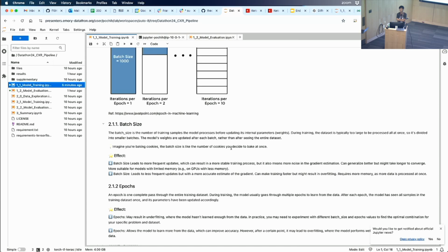Okay, until AI, by doing these small bites, covers the entire 100,000 with X number of batches, then we say that we finish one epoch of training data. And again, in real life, one epoch is still long. Because we repeat the same exercise many, many times, probably usually 10 to 30 epochs in practice, or even more.